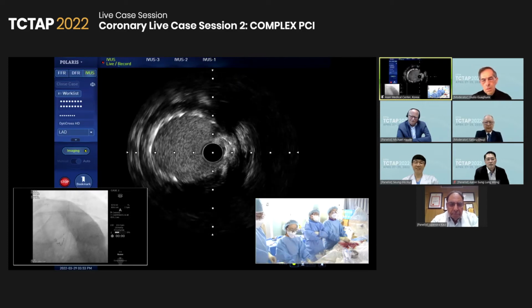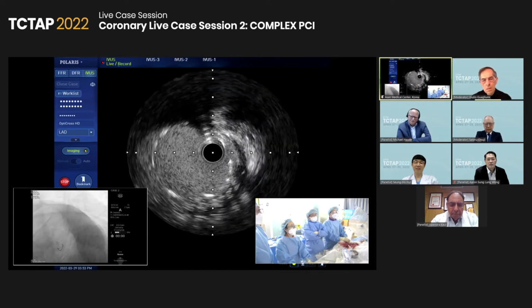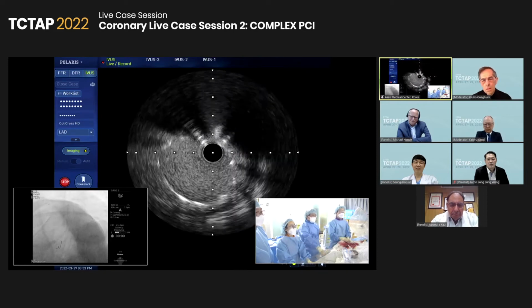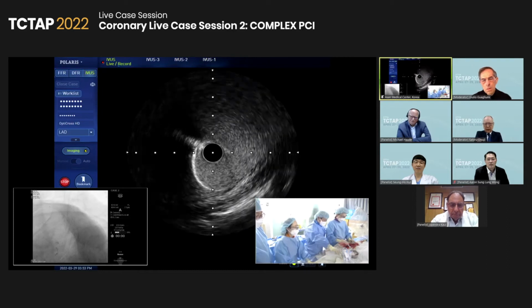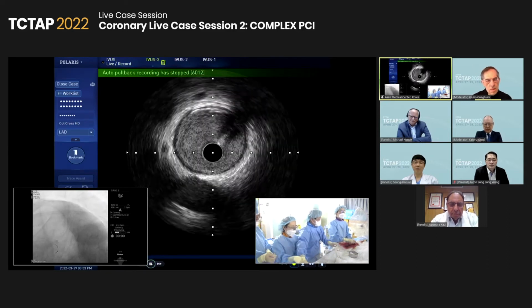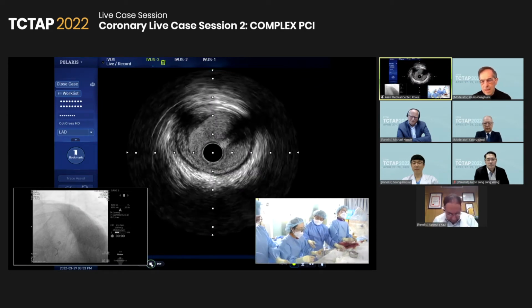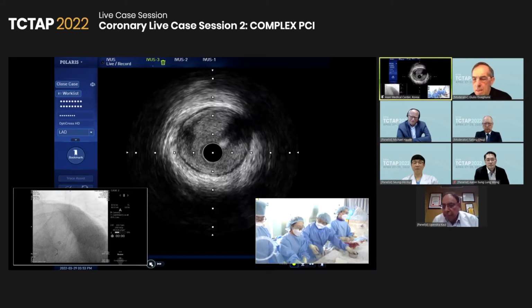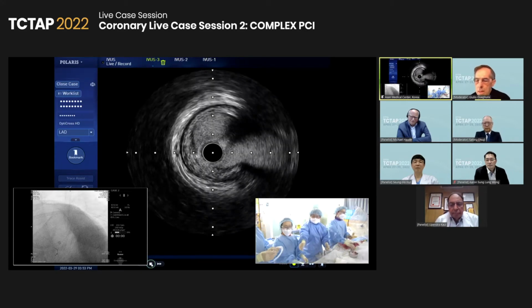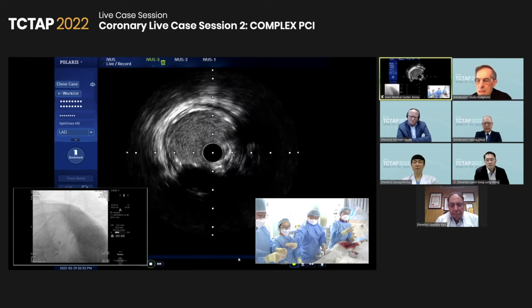Yeah, it's the left main. It seems very good. And the stent was placed just at the ostium, the entrance of the stent at the ostium. Yeah, 4.0 for the high pressure balloon. Yes. We need further dilation of the left main, especially for the left main ostium.